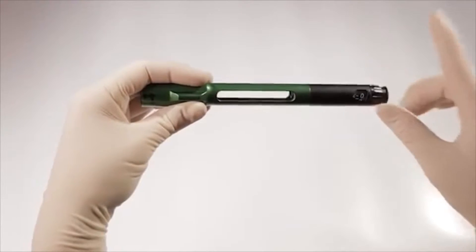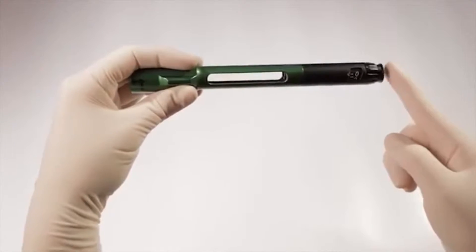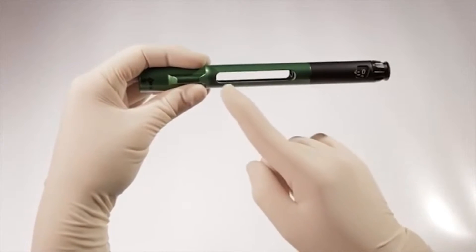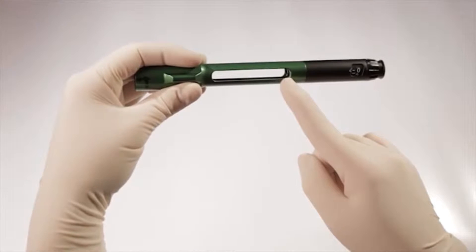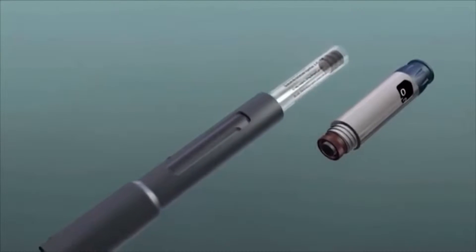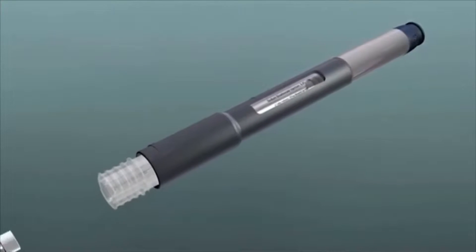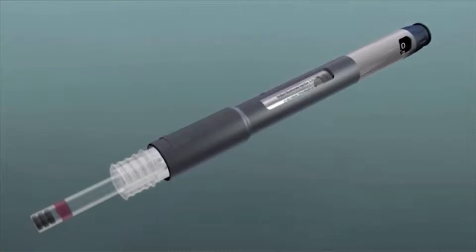The mixing pen is comprised of two main parts: the body, which contains the volume dial and dispensing components, and the cartridge chamber, which houses a 3-milliliter cartridge. When used with a cartridge connector, the pen and connector create a sterile fluid path for connecting the 3-milliliter cartridge with a 1.8-milliliter cartridge inserted into the connector.